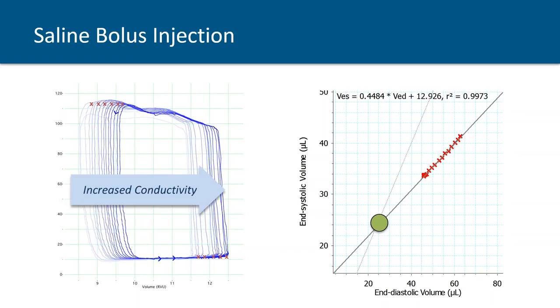It's also important to realize that the gain factor that you collected from your reference measures of stroke volume or from the cuvettes also needs to be applied to this parallel conductance correction factor. So just doing parallel conductance is not sufficient to get absolute volumes.